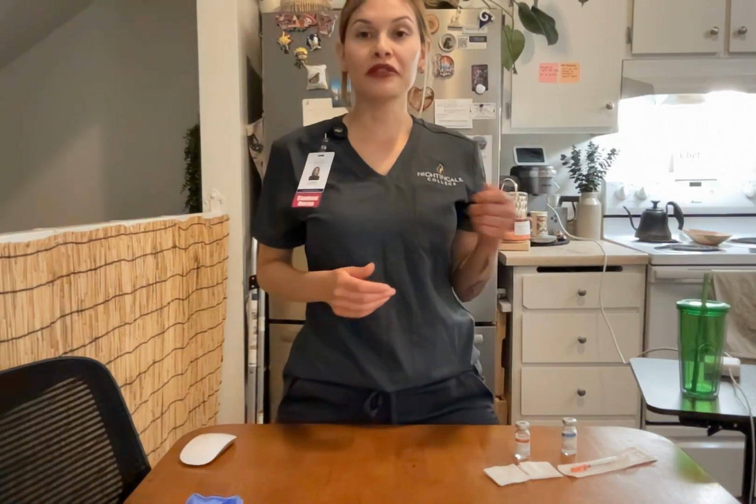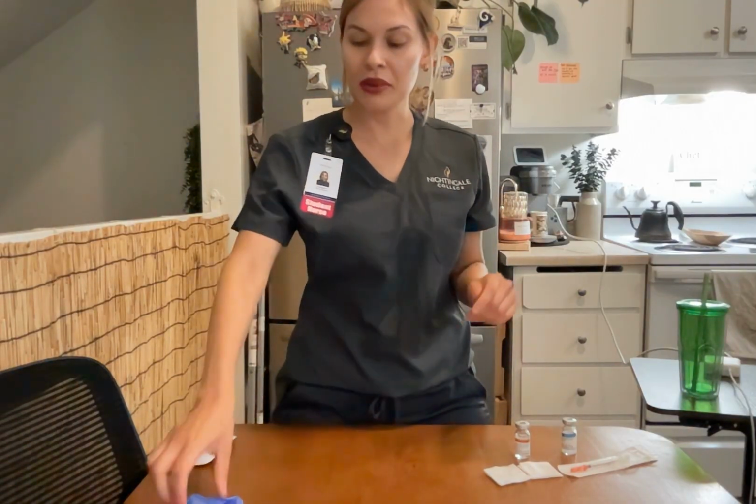Next, check the medication order in the EHR. And introduce myself to the patient with my first name, provide for patient privacy, identify the patient with his full name and date of birth, and those are the 2 patient identifiers. In addition, ask the patient if he has any known allergies to medication, food, seasonal allergies, or other. Perform hand hygiene and apply clean gloves.